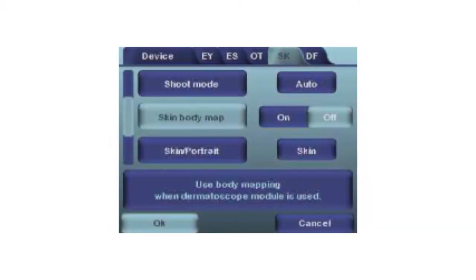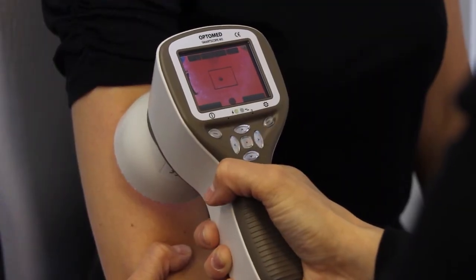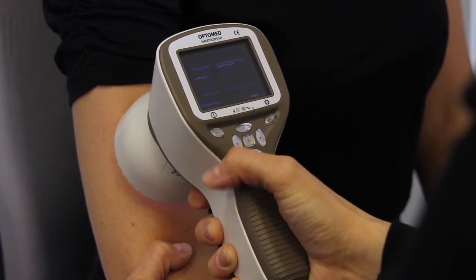Skin body map: the skin body mapping feature can be used for marking the body part that was photographed on the image file name. The camera will display options of different body parts after the image was captured. Choose the correct body part by using the arrow keys and soft key.